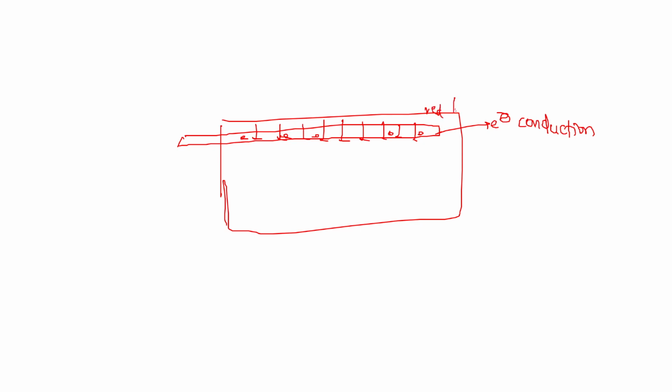Now this cassette is placed into the machine and loaded onto the laser beam. The electrons are present in the conduction band. When we load this phosphor plate inside the laser beam, the laser emits red light, and the electrons in the conduction band come back to the valence band.